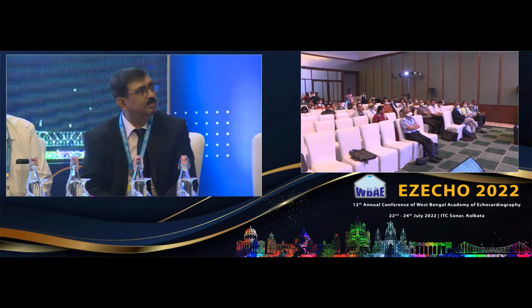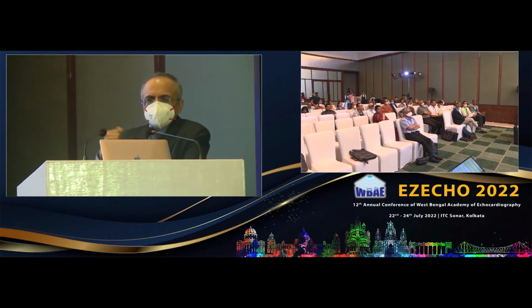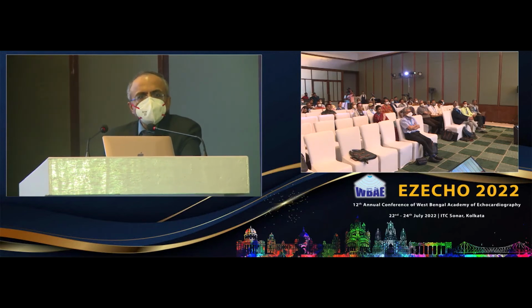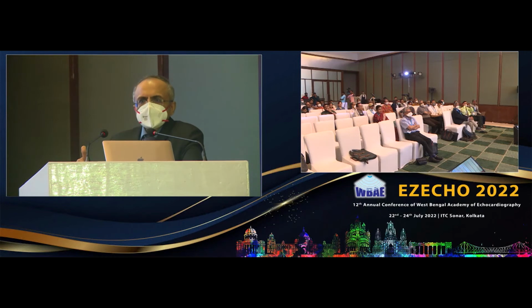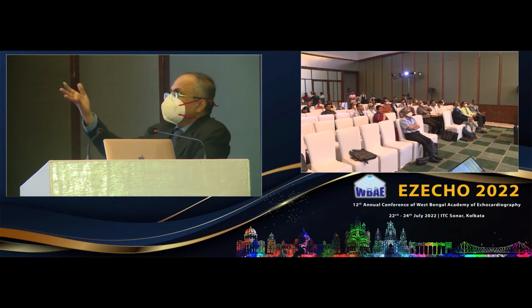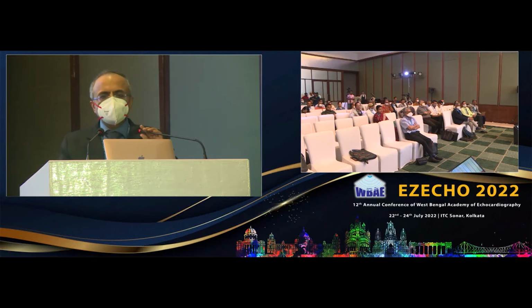Yes, I think it's a very valid point, because commonest things are common and they will be more common. So you will be right when you have a more common diagnosis. So whenever you have an LV dysfunction like this and a focal abnormality, in the same CMR study, if you do an adenosine stress perfusion, you have an ability to rule out ischemia. And also in the late gadolinium, if you have subendocardial scars, you know that you are also dealing with an associated ischemic heart disease. So that is how the test becomes more wholesome. So you have these LG patterns of a myopathy also, but at the same time, with the combination of stress perfusion and LG, you can also rule out ischemia simultaneously.